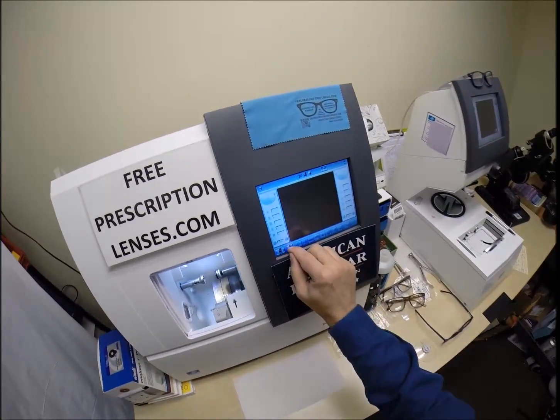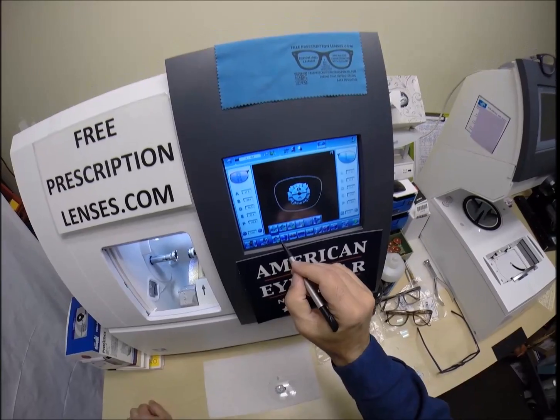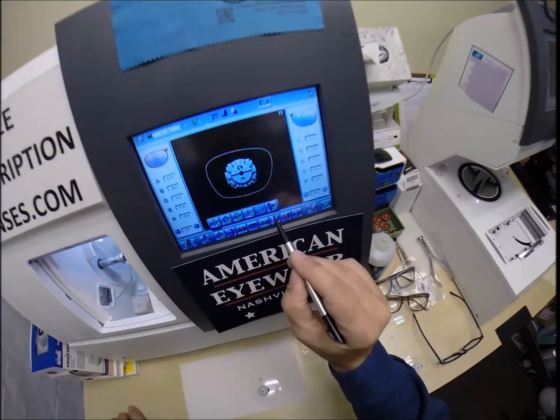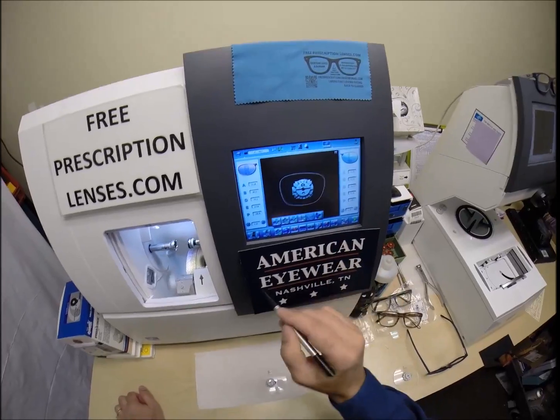I'm going to press this on there. Actually, let's pull up the shape on the computer. That is the shape of the lens we'll be cutting. These are polycarbonate lenses. If they were plastic, high-index plastic, or Trivex, I would select that. Those are different lens materials. Better yet, to be determined later, TBD. They're going to come out with some lens material, and I'll be able to cut it then.